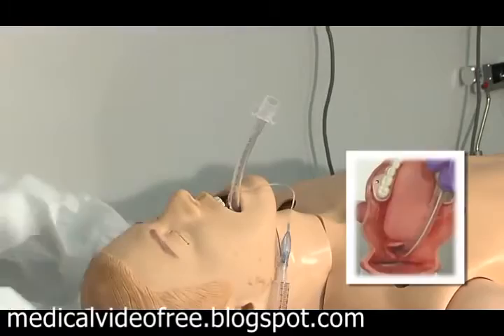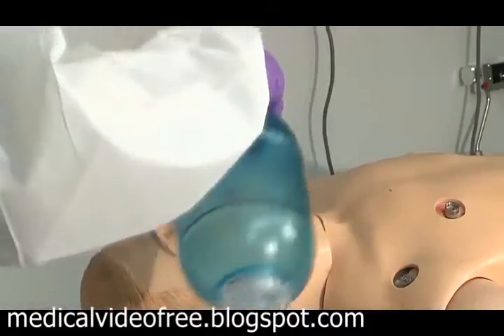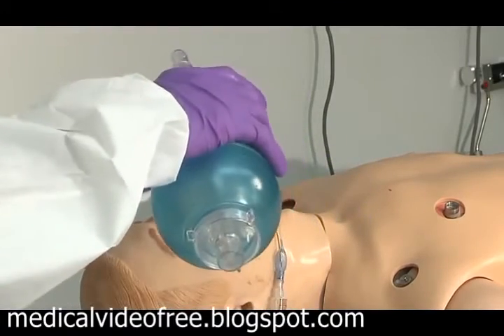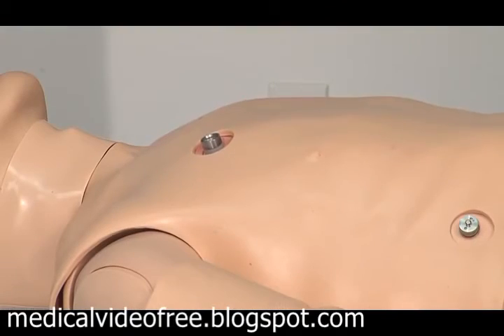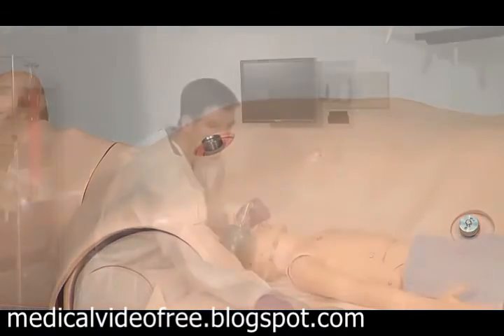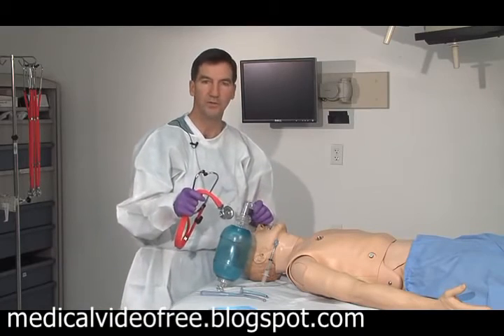The stylet comes out. The cuff is inflated and the patient is ventilated. Watch for rise and fall of the chest, then auscultate to hear breath sounds on each side with no borborygmy.